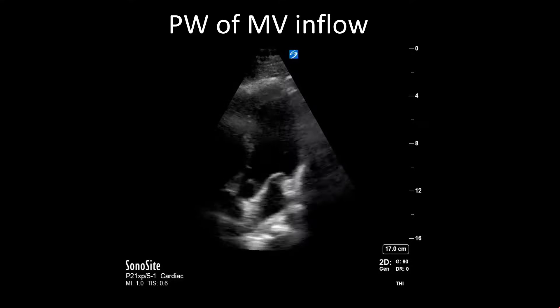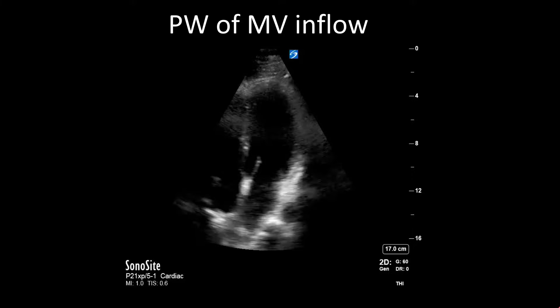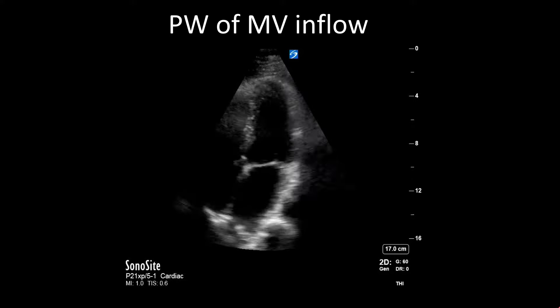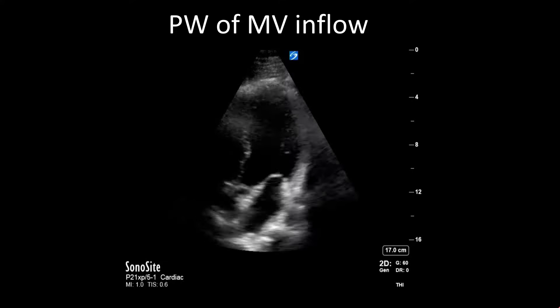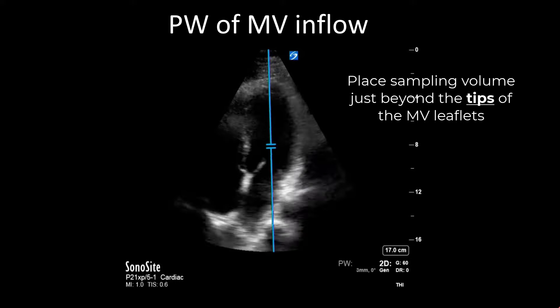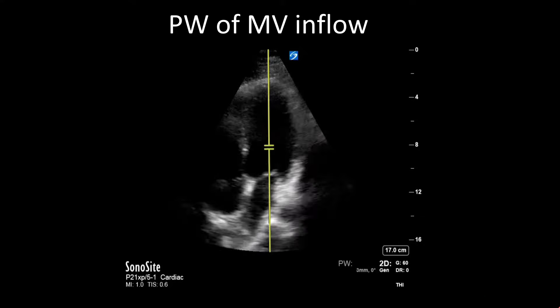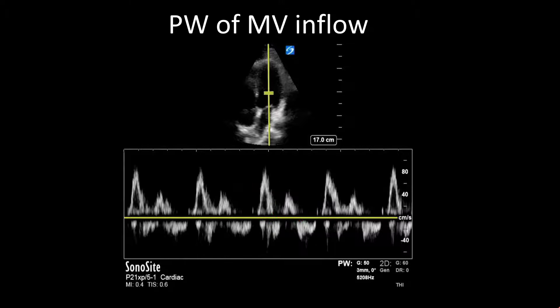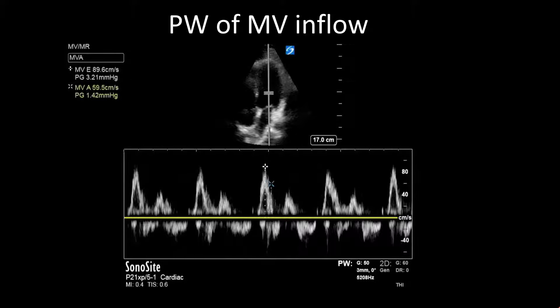Now let's go through how to obtain the measurements at the point of care. First, pulse-wave Doppler of mitral valve inflow. Your first step is to ensure you have an apical 4-chamber view, with the septum perpendicular to your ultrasound probe and the LV cavity well-centered on your screen. Once you've optimized your image, choose PW (pulse wave), which will drop your sampling volume, which you then place between the mitral valve leaflets as they open in diastole. Press PW again and you obtain the tracing showing your E and A waves. Using the Calibre tool, you can measure the velocity of your E and A waves. Most machines have a preset that shows your E-to-A ratio directly.